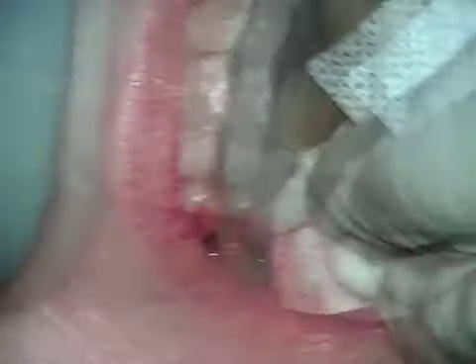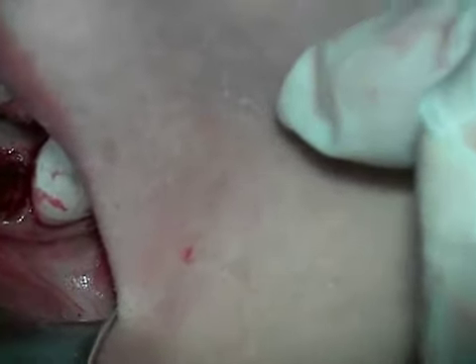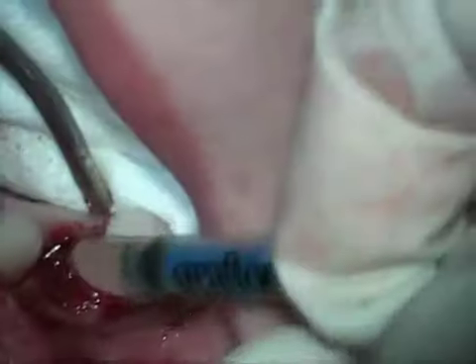And now that we've got the osteotomy drilled, we're going to take out the surgical template. Now, if you were drilling the implant into solid bone, you could leave the surgical guide in and place the implant right through it, but I like to take it out at this point so I can inspect the osteotomy site. You can see that there is a small perforation in the floor of the sinus, but the membrane's intact, so we're going to inject some Grafton gel right into the site and then pack it down with the back end of my periosteal elevator.